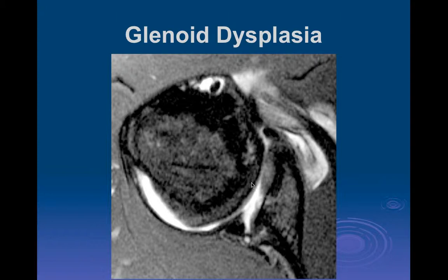It looks just like a Hill-Sachs, but this individual did not have anterior instability. He obviously has posterior instability, not anterior instability. And this was impaction from chronic pitching from posterior impingement. So that was a re-tear. Is the retroversion due to the chronic impaction, or is it still congenital? The retroversion is congenital.